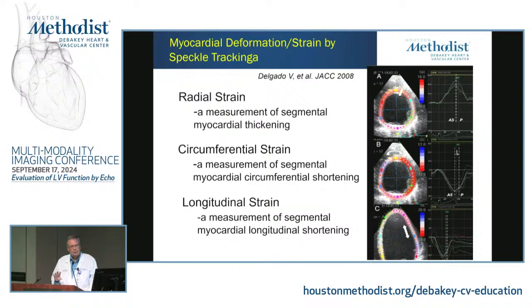And circumferential strain has been used less, again because of the clinical applications, given that patients with HFpEF, patients with hypertrophic hearts and whatnot, will still maintain a good circumferential contraction. And you see that. You don't need a strain to know that, because you do short axis imaging and you see that beautiful contraction of the heart in a short axis.